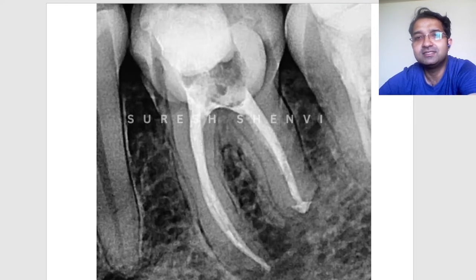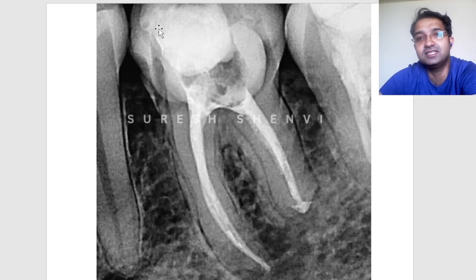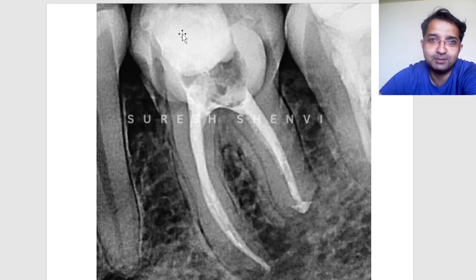Post-operatively, I finished the RCT. You can see I removed part of the core buildup material but there is still some decay visible on the distal side. A temporary material was placed, and after obturation I waited one week — the patient is completely asymptomatic. Healing will take time; for such a big lesion you generally wait three to six months to see significant radiographic change, but clinical absence of symptoms is sufficient to proceed with post-endo restoration.